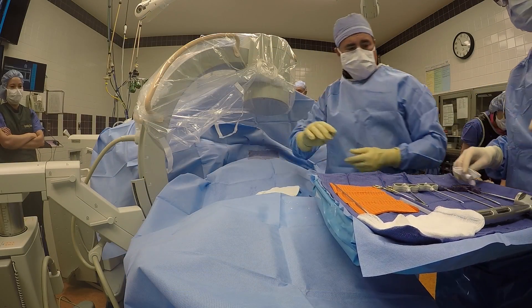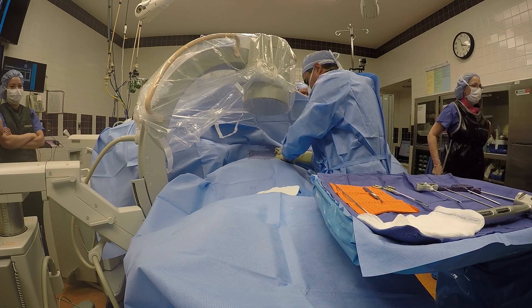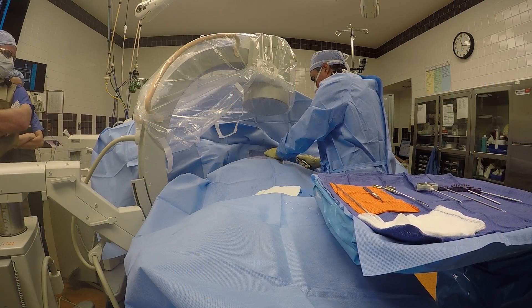Working channels are inserted through the skin into the bone under x-ray guidance. In this picture, the patient who is awake but sedated is lying on their stomach.